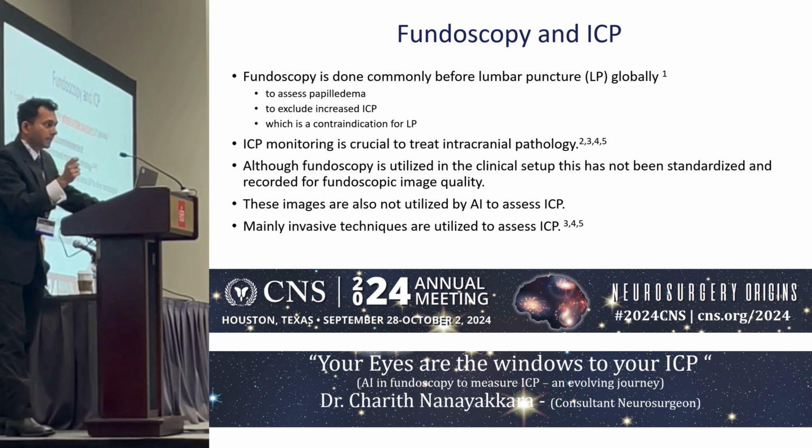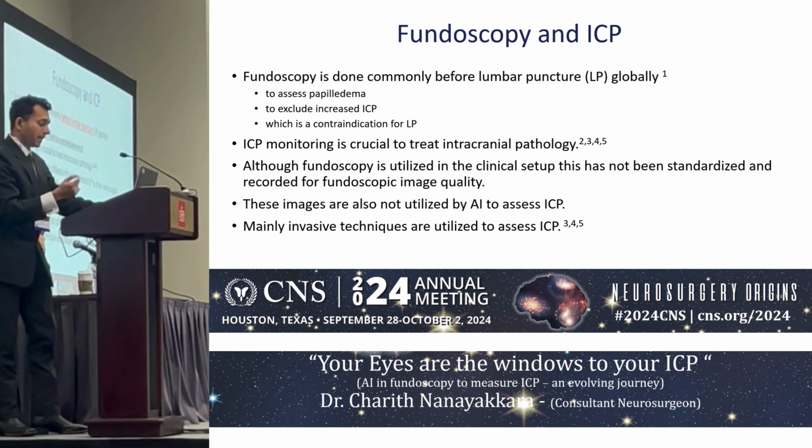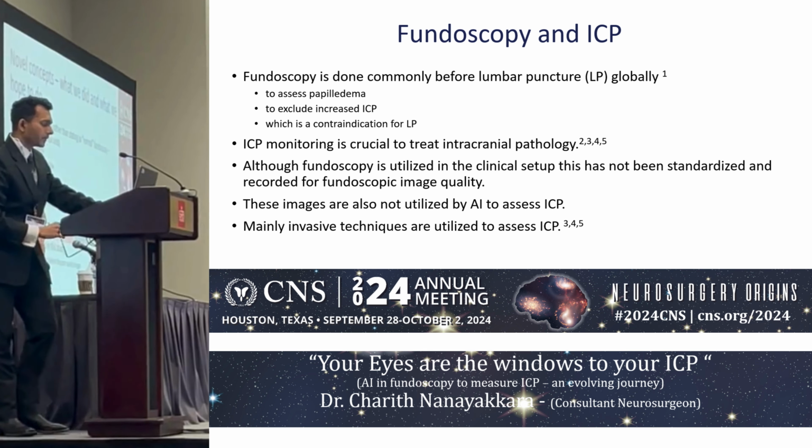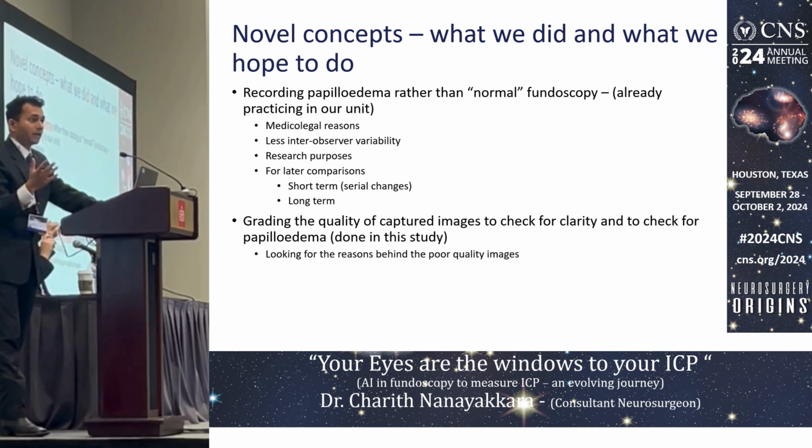This has not been standardized and recorded for fundoscopic image quality. So these images are also not utilized by AI so far to assess ICP, and mainly invasive techniques are utilized to assess intracranial pressure. So now the concepts: what did we do here and what are we going to do?